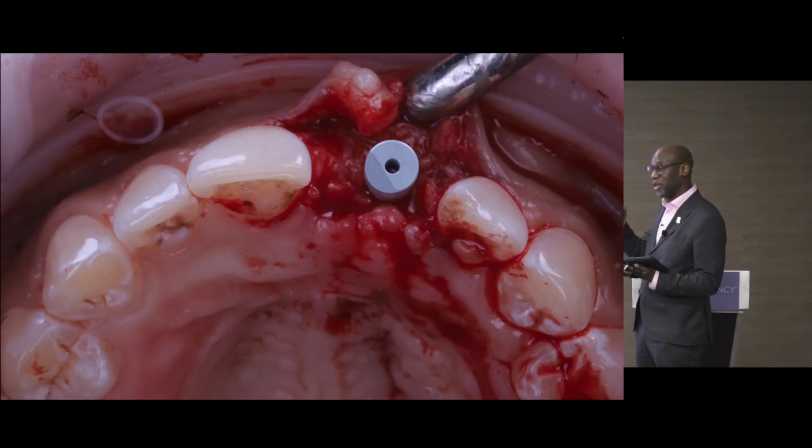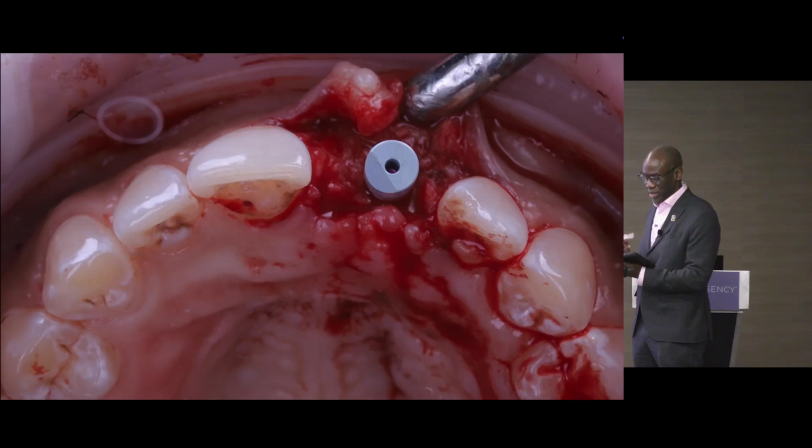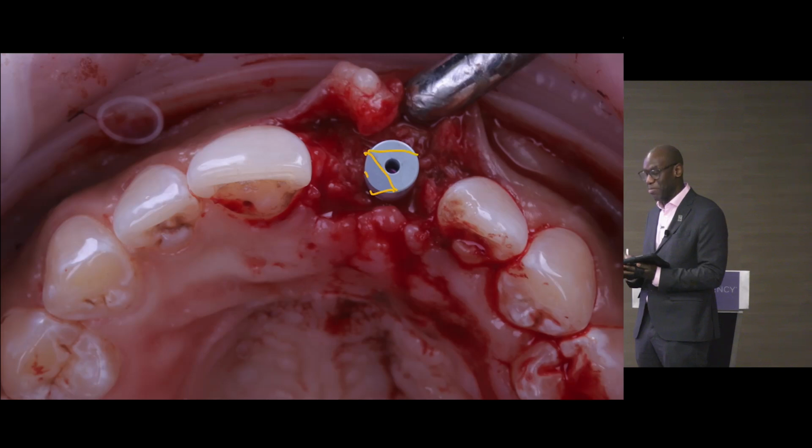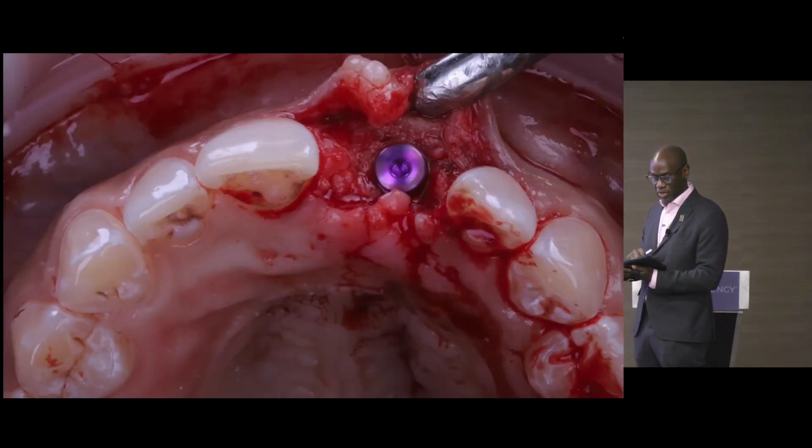So what we're going to do is scan the patient at the time we place the implant and then make the ideal shaped tooth. Sometimes, if we have not planned for using the HBG, which would mean having this slope facing buccally in the correct orientation to take advantage of the angled screw access, I'm not able to do that. So it's off to Steve and I say, listen, I'm sorry, I didn't realize, can you make me the ideal shaped tooth based on that?